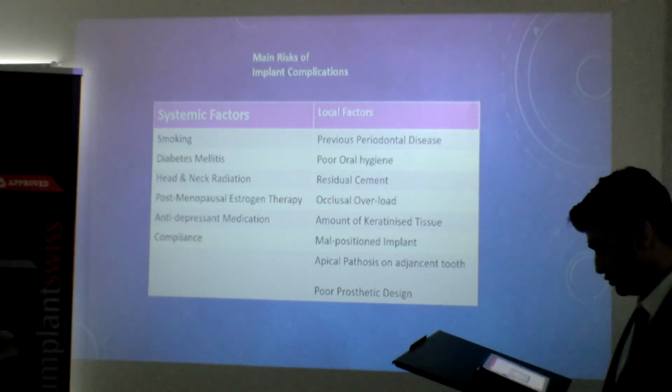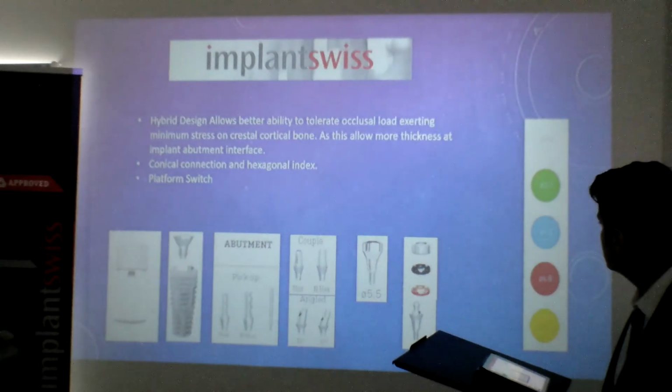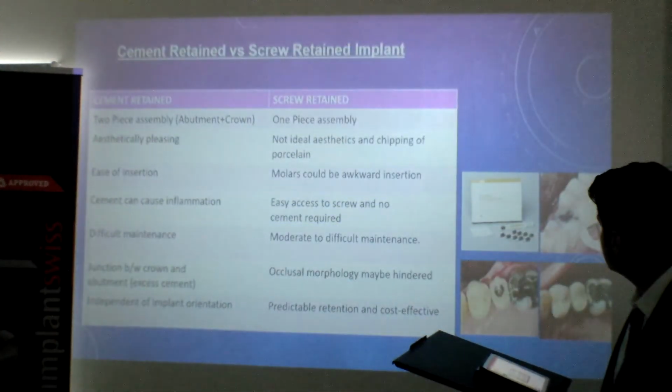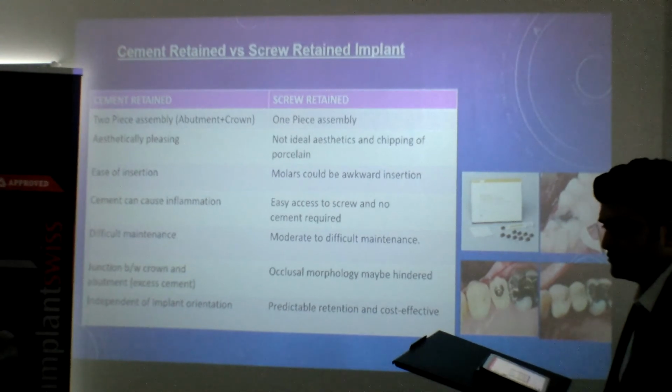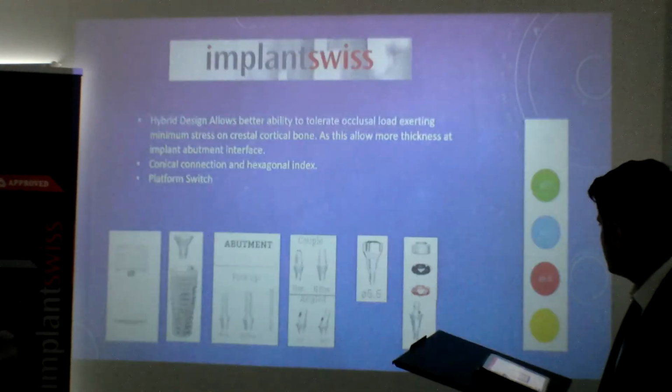Another issue that you have is, let's go on to, okay, I think that's jumping too far forward. Cement retained versus screw retained. The other issue with cement retained, now in an aesthetic zone, would you be doing cement retained or screw retained? Screw, okay, if you can. Problem being that, yeah, okay, go ahead. I'm not sure about that. I think we've jumped a few slides. Let's go back and we'll talk about it.